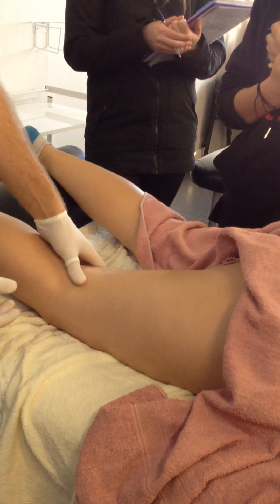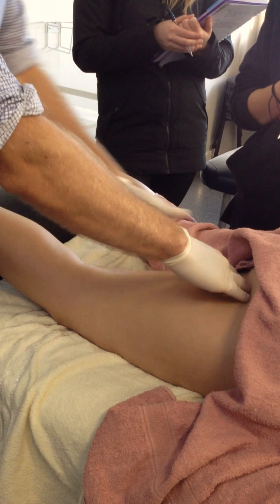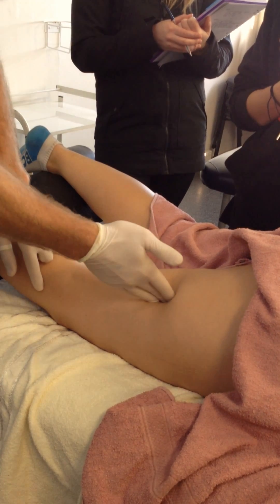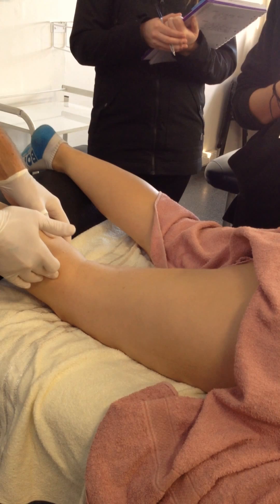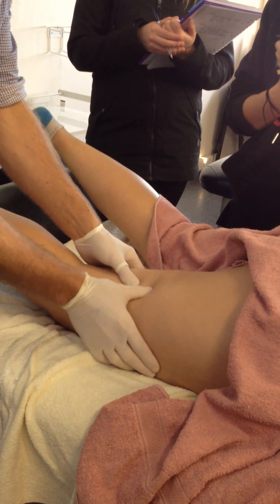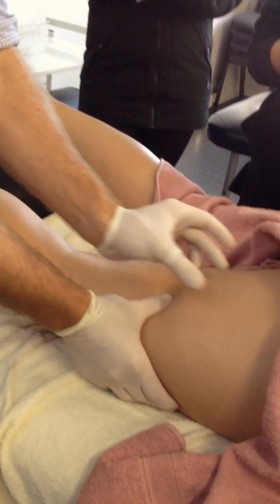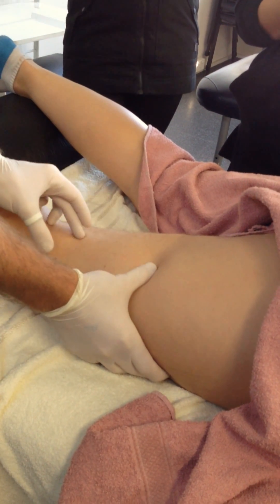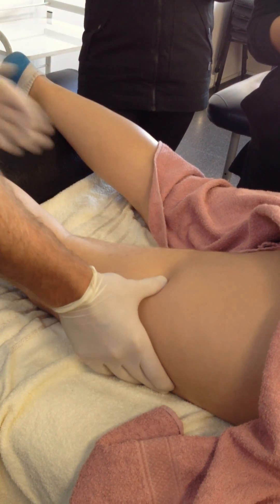As we said, biceps femoris has got two heads: one that comes off the ischial tuberosity onto the fibula, and one that comes off the back of the femur and down onto the fibula head as well. Palpate it with some cross-fibre, differentiating between the lateral hamstring — so biceps femoris — and semitendinosus and semimembranosus medially.